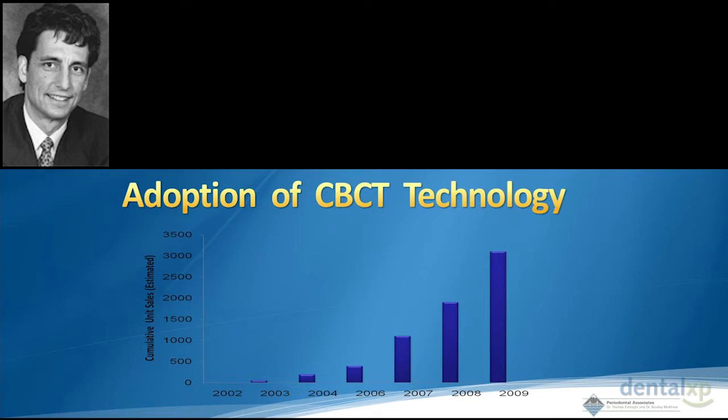And ultimately, there are some cases where it's the true placement. I've removed a tremendous number of implants. Obviously, the ones that he showed did have a slight error in the placement, and that's why they resulted in lack of buccal plate. But on a daily basis, we're seeing cases come into our office where these implants are placed completely out of the bony envelope, no regard to the 3 dimensions.